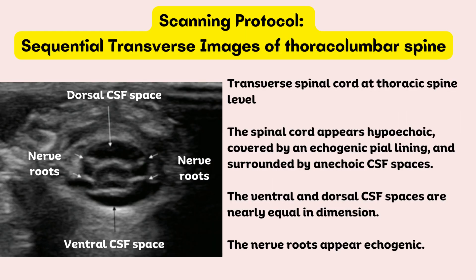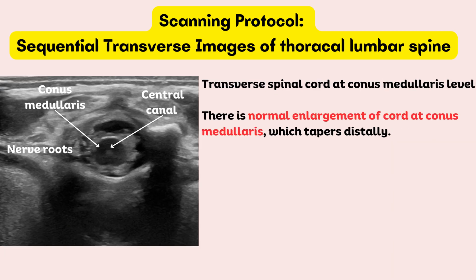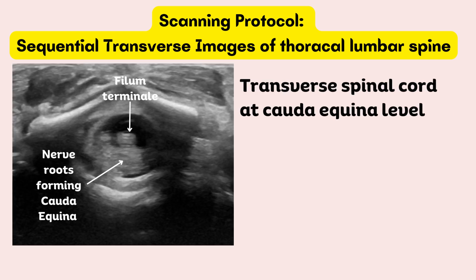On the transverse plane, sweep from the mid-thoracic region to the sacrococcygeal region, taking sequential transverse images of the thoracolumbar spine. At the thoracic spine level, the spinal cord appears hypoechoic, covered by an echogenic pia lining, and surrounded by anechoic cerebrospinal fluid spaces. The ventral and dorsal CSF spaces are nearly equal in dimension, and the nerve roots appear echogenic. At the conus medullaris level, there is normal enlargement of the cord which tapers distally. At the cauda equina level the cord transitions into the nerve root bundle.